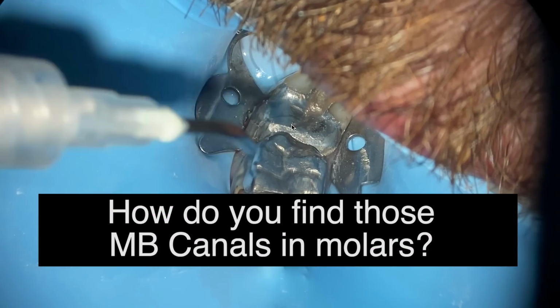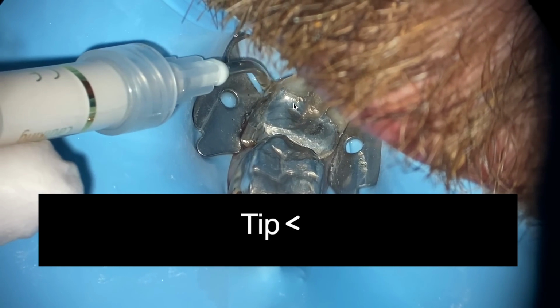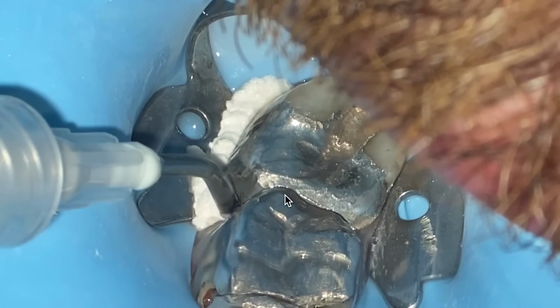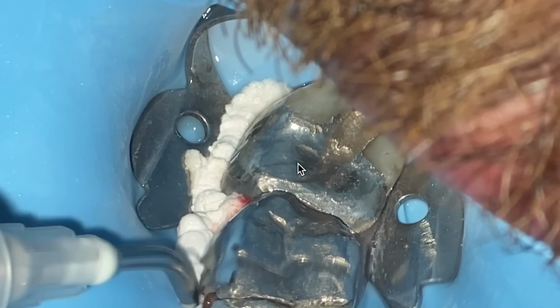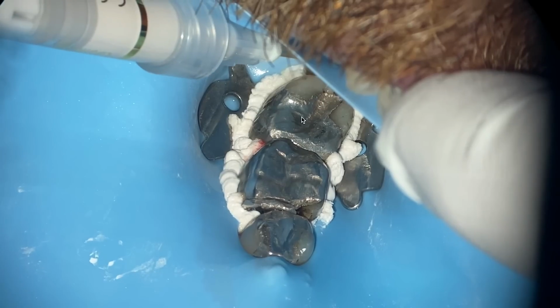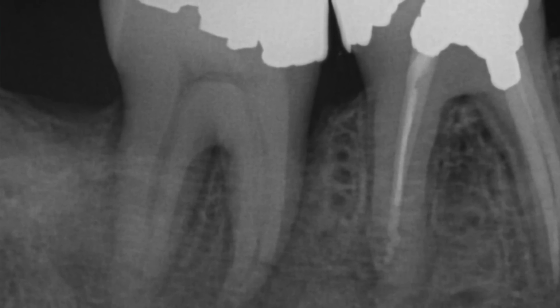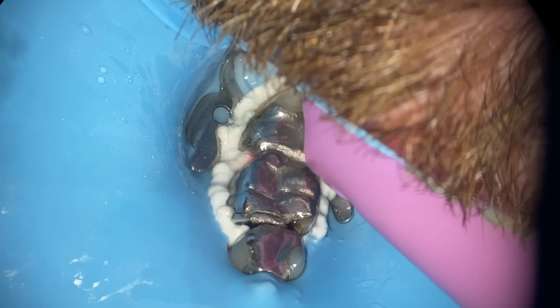And you know what? This is a great example, because what's happened here, the first tip I can tell you of looking for these difficult canals is that we've already got a large amalgam restoration on the tooth. This amalgam is probably, who knows, like 150 years old, and that pulp has regressed. A lot of difficulty in trying to find that mesial buccal canal.